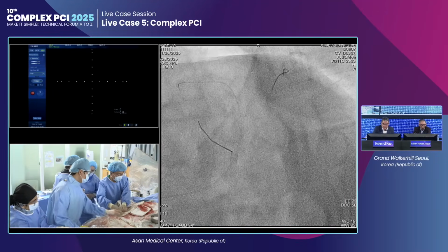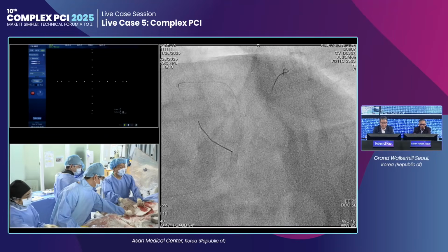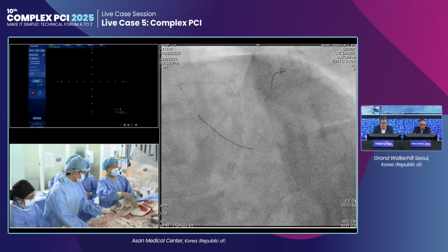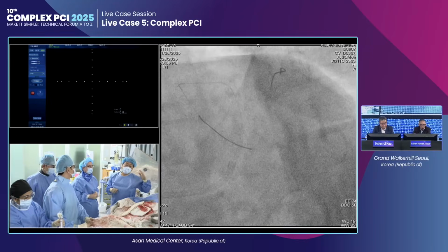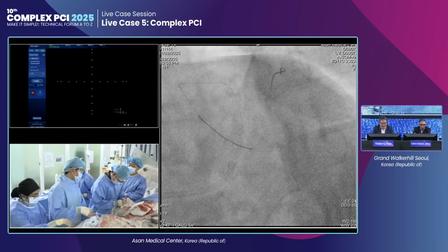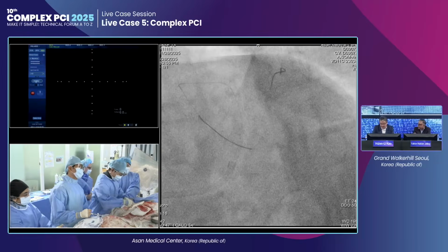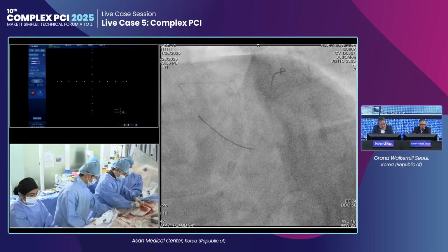If you want to do FFR, we can do FFR. I think it would be very teaching. All right. Anyway, it's nice to do predictions, but science is made by facts. Dr. Kao, if FFR is negative, what would you do then? If FFR is negative, you are the boss. Just leave it. How would you do that, Dr. Kao? Negative FFR.